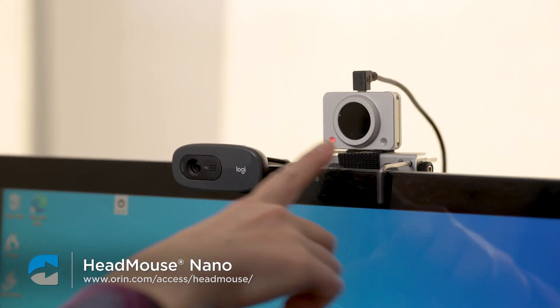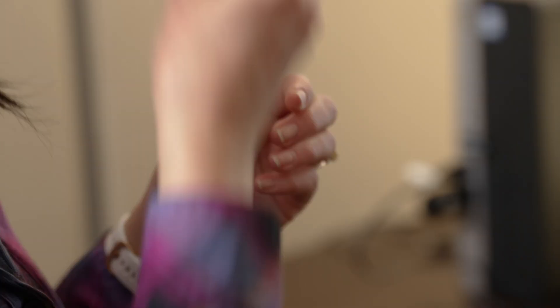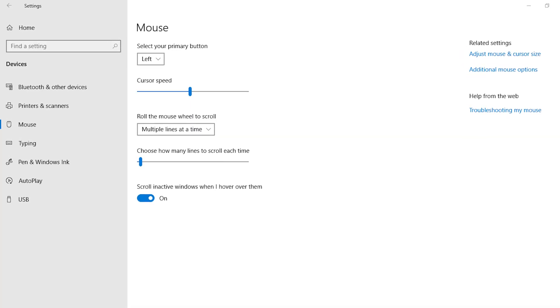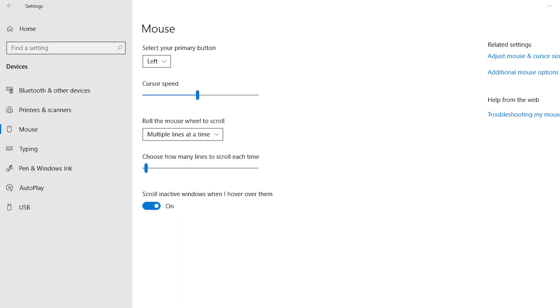With the Head Mouse Nano right here, you use a reflective dot that you would place on your forehead, or on your glasses, or on the brim of a hat, for it to read the position of your head to move the cursor on the screen. If you wanted to adjust the sensitivity of this mouse, or the other mouse options that I described, one option would be to go to the computer settings on your Windows computer and change the cursor speed.